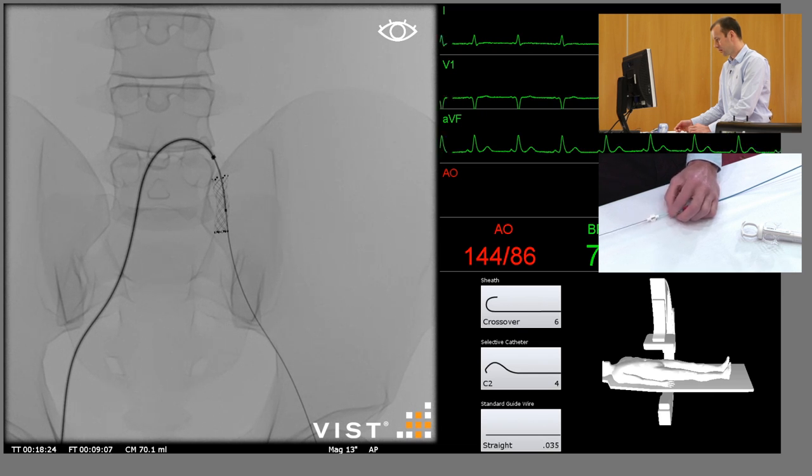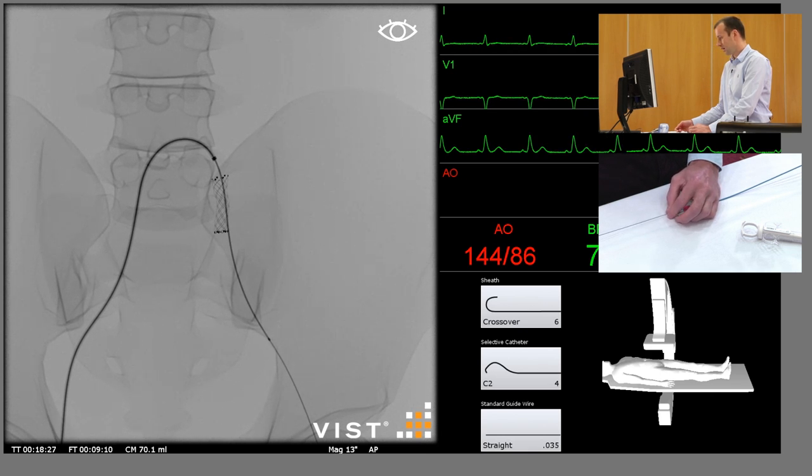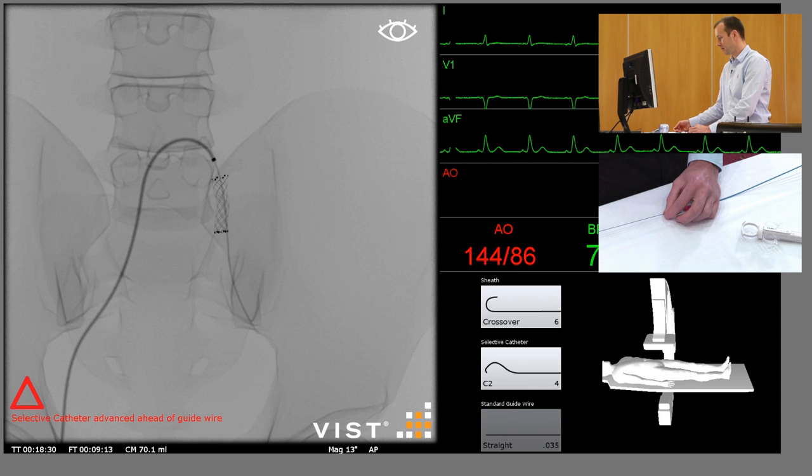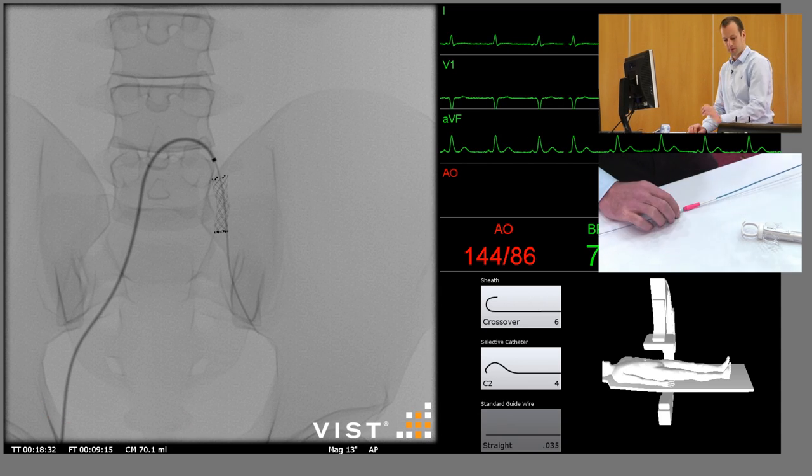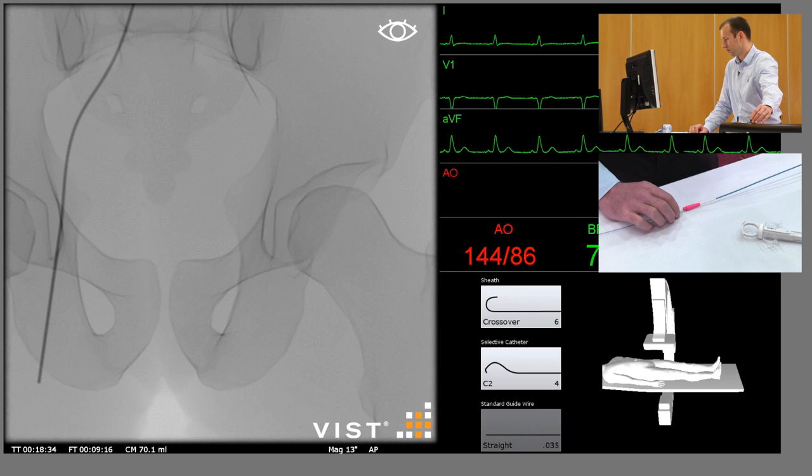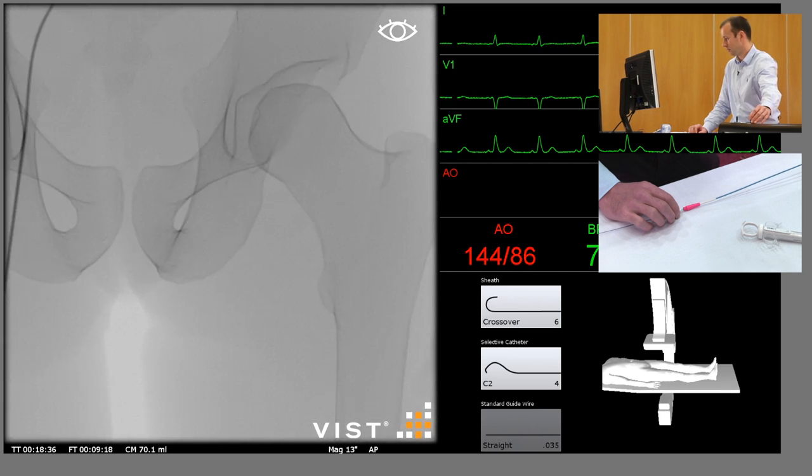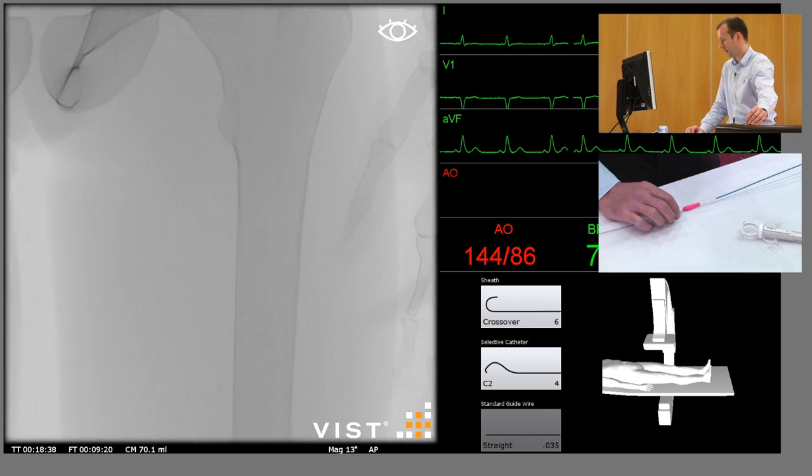Past the lesion we've just treated, into the external iliac artery. Remove the guide wire, center the image intensifier further south.